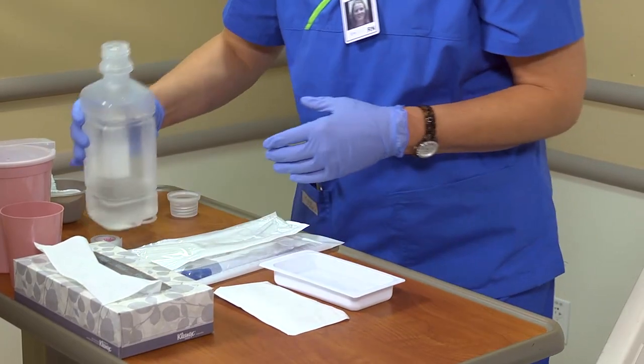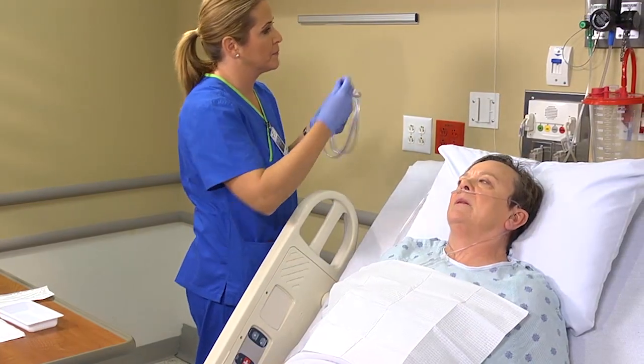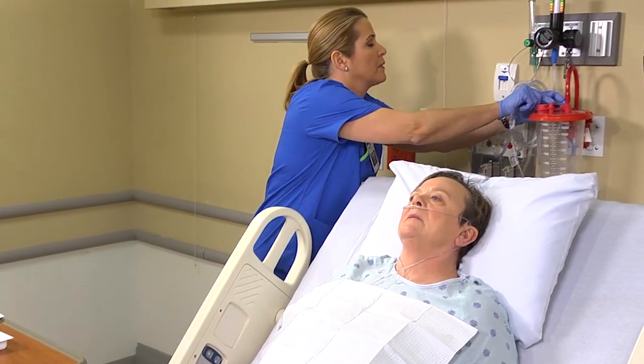Fill a cup or basin with about 100 milliliters of sterile water or sterile saline. Connect one end of the tubing to the suction machine and turn on the suction.